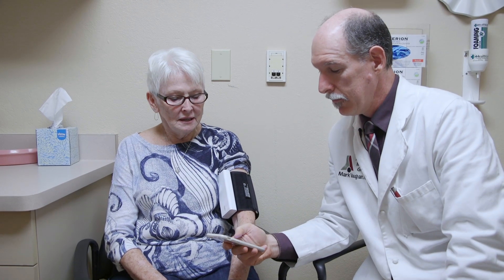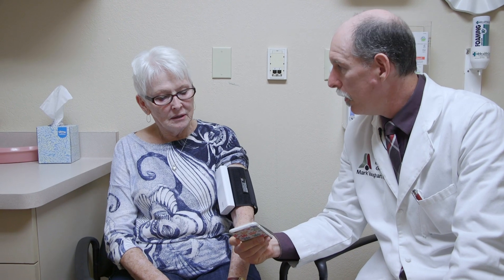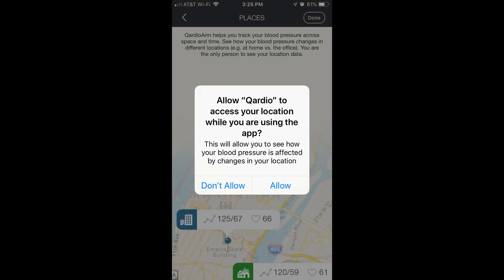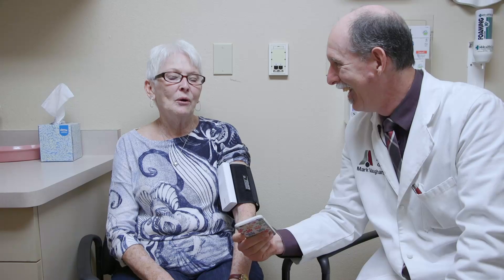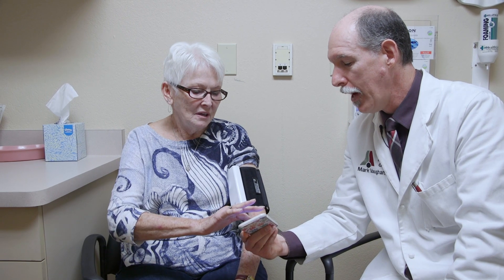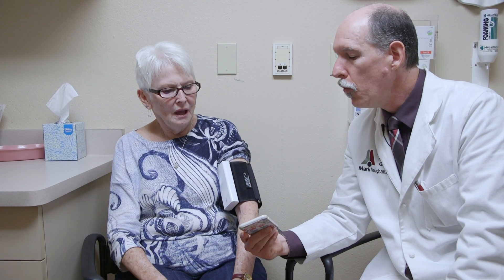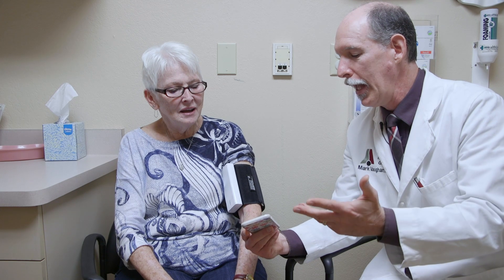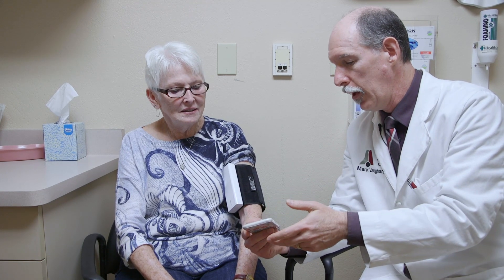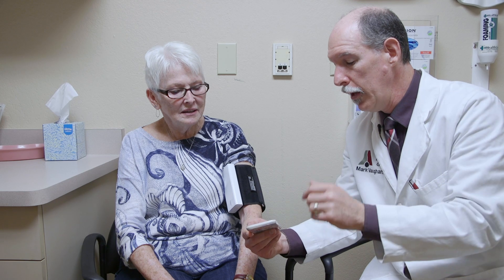Hit next. It wants to know if you want to allow access to your location information, so it can tell you your blood pressure is high at the doctor's office or low at your accountant's office. Hit allow. It will track that — you'll be able to look at it and know where you were. You can even write a little note saying 'Dr. Vaughn's office.'